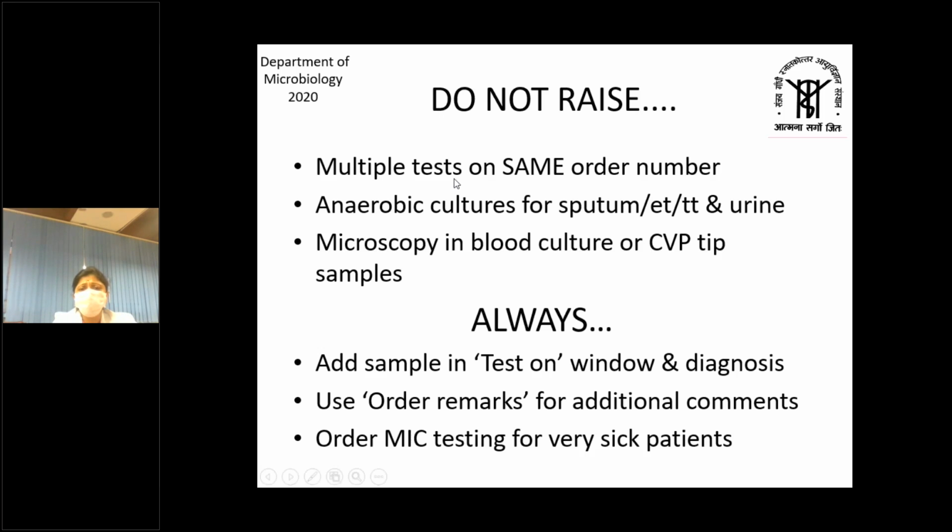Please remember, do not raise multiple tests on the same order number, because usually we require separate forms for doing our own lab logins and maintaining lab numbers. So it is best if you raise one test on each form. For example, microscopy and culture can be raised on the same form, but if there are investigations from different sections, then it is better that you raise separate forms for each section.